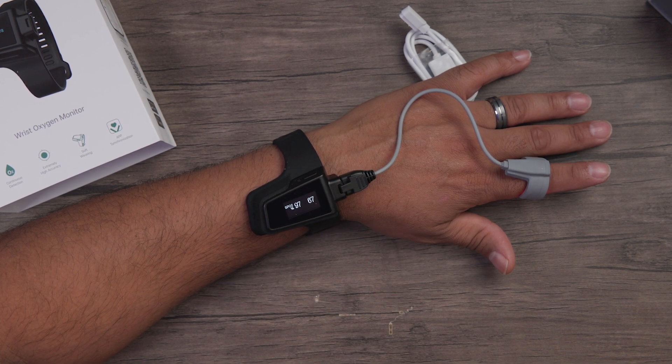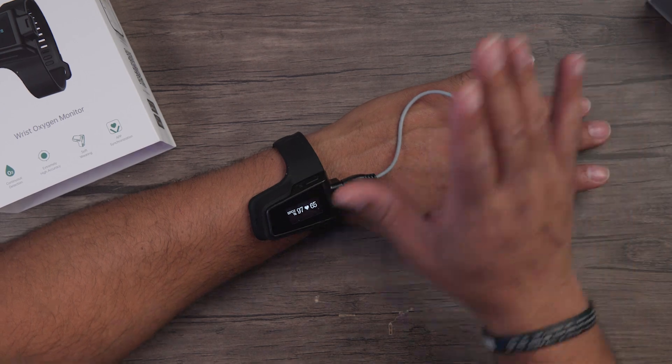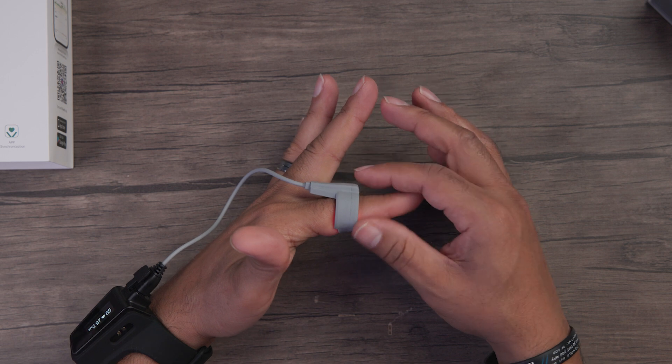It's currently set so that if the heart rate drops below 50, it'll start vibrating and giving alerts. What's funny is I was just laying on the couch and it hit 48 for my heart rate, and I started getting the buzzing and vibration alerts. My resting heart rate was about 48 — I like to take care of myself. You can also see a little light on the finger sensor as it picks up the pulse. If I press this button, I can also check the time and battery life.